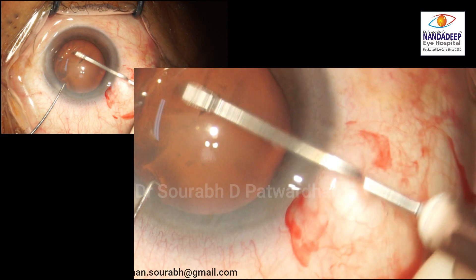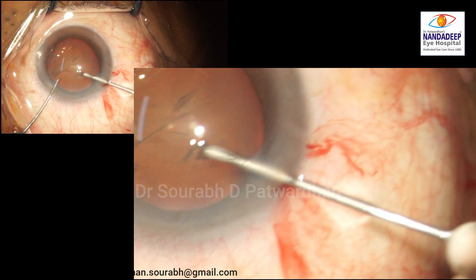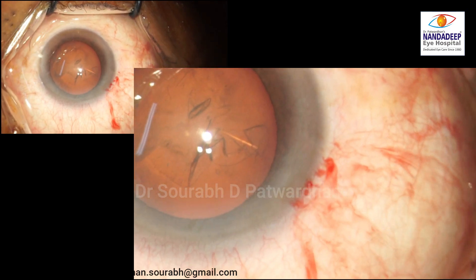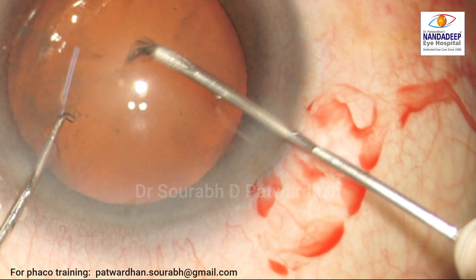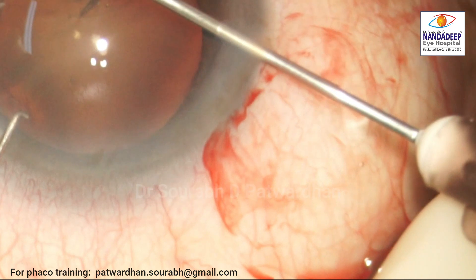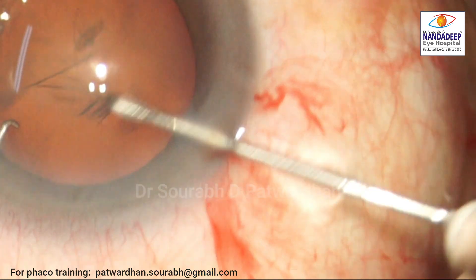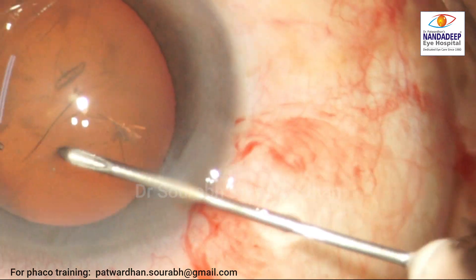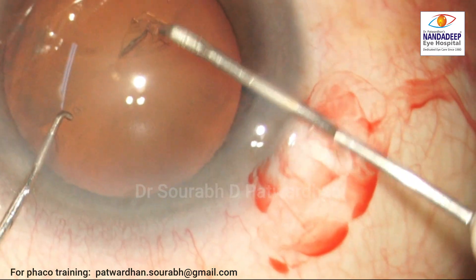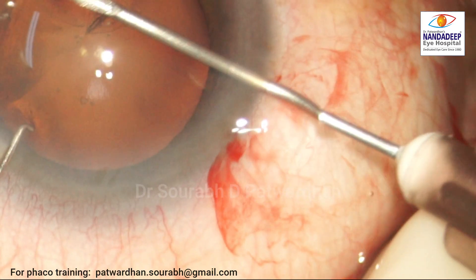You can see the viscoelastic is continuously coming out from the incision. And I am not pressing the posterior lip of the incision. And that led to the capsulorhexis trying to go out. So what is really happening over here — why is this OVD leaking so quickly? And I know that is the reason why the capsulorhexis started going out. So I have to find out why this was happening.